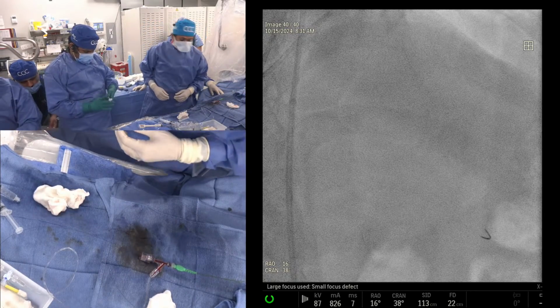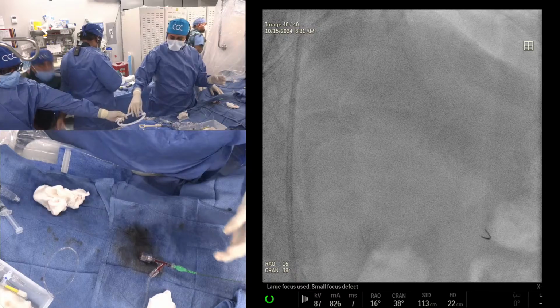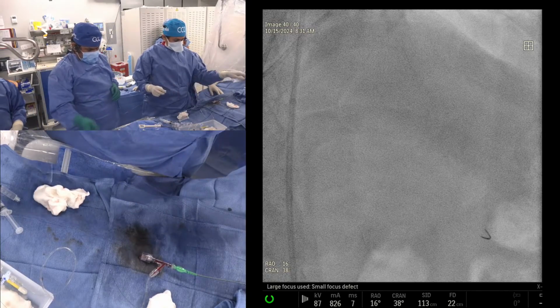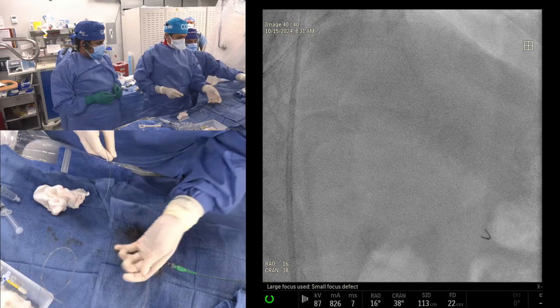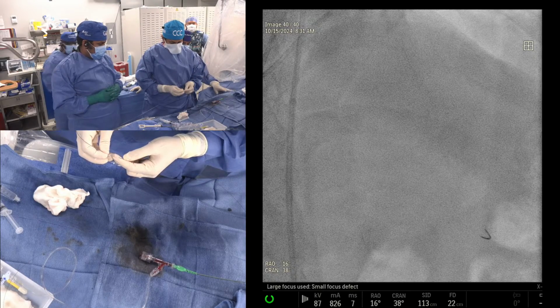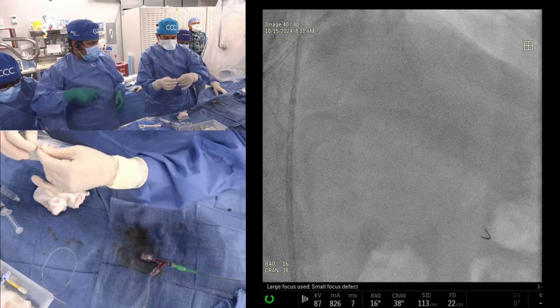When you're doing a CTO, you need a nice finesse to do it, and just focus on the proximal cap and exit the distal cap. We are dilating with a 2.5 by 30, and we'll ask if people want to do IVUS or anything. We have the IVUS ready in case we need it. It will be a good one to see that truly there is no calcium. I'd be even more interested to know the true size of the vessel. It may be completely underfilled and larger than it appears angiographically.